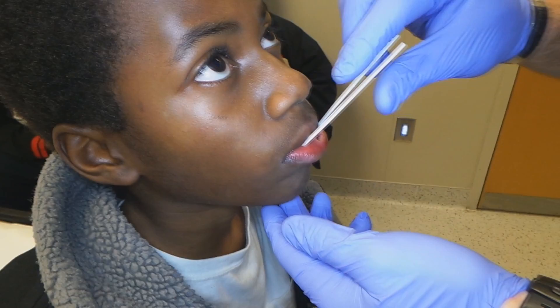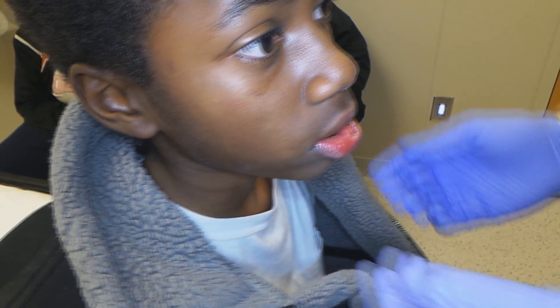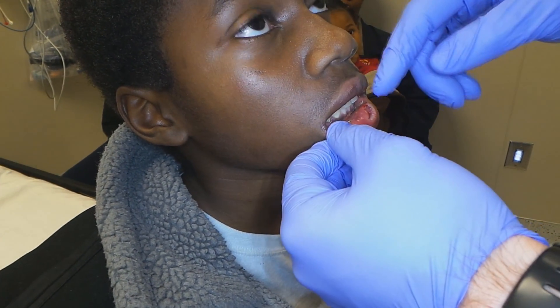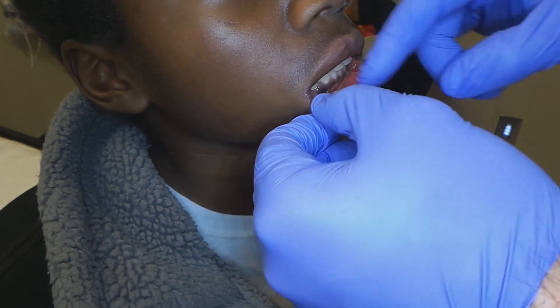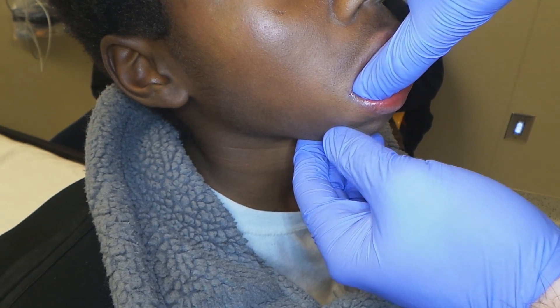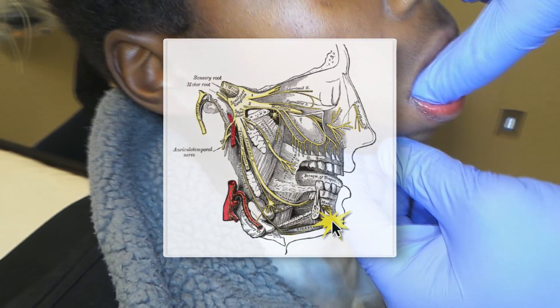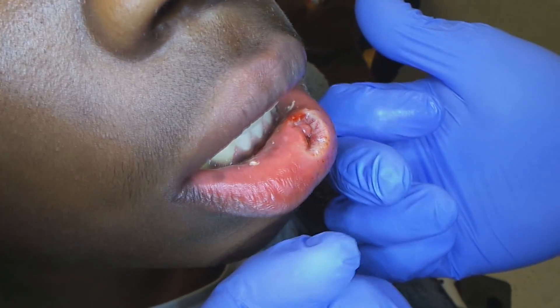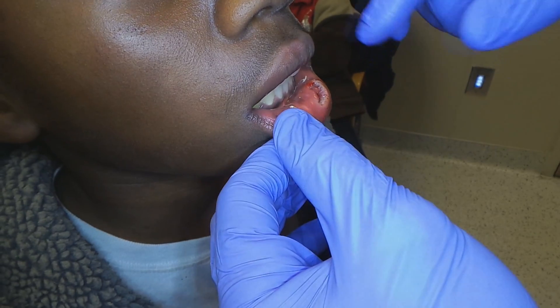When you approach the patient, we already have him numbed up and we've already located where we were going to go in. When you want to locate where the mental nerve exits, there's a couple ways to palpate. He's a kid — he doesn't have premolars. On an adult, you'd look just anterior to the second premolar. For him, it's going to be just posterior to his canine. You put your finger down inside the reflection of the buccal mucosa and just feel for the little notch of the foramen where the mental nerve exits. You can just feel it right there posterior to that canine. The reason we did both sides is the laceration approaches and is almost on top of the midline, and you do have some crossover fibers from those mental nerves — we want to hit both sides to make sure crossover fibers aren't innervating the middle of this laceration.